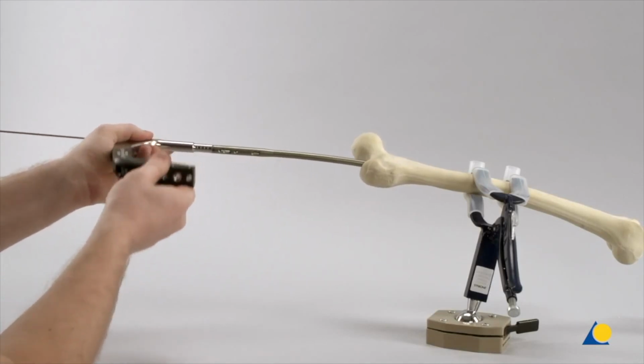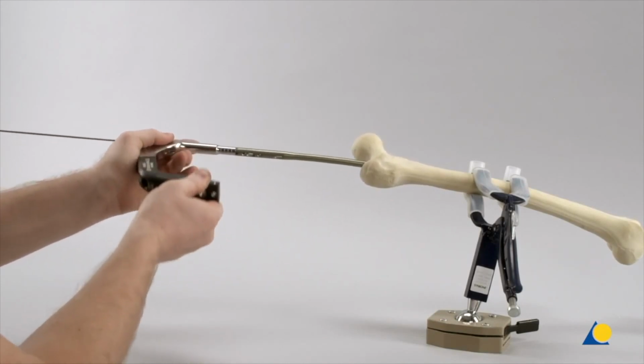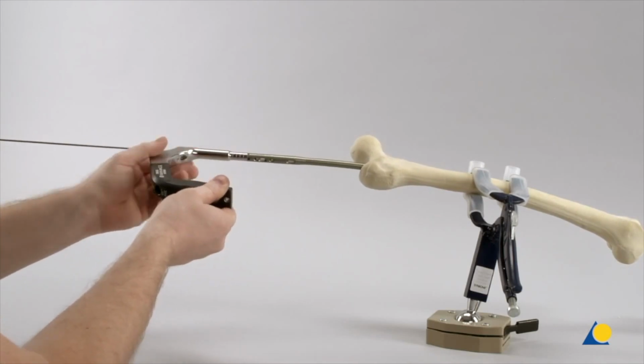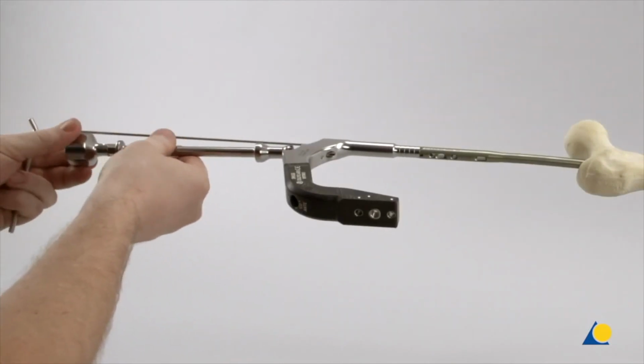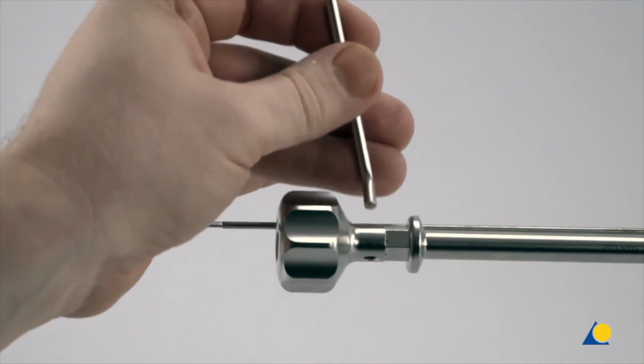The passage of the nail across the fracture is monitored under image intensification in both the AP and lateral planes to avoid malalignment and to verify the fracture reduction. The driving cap with thread is manually connected to the insertion handle with clockwise turns and tightened with the pin wrench.